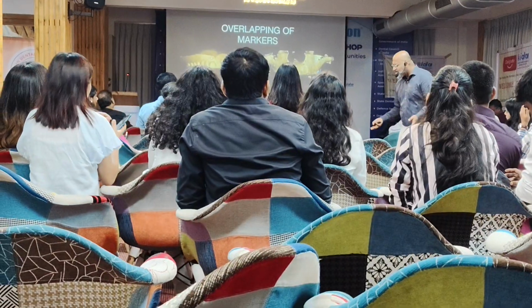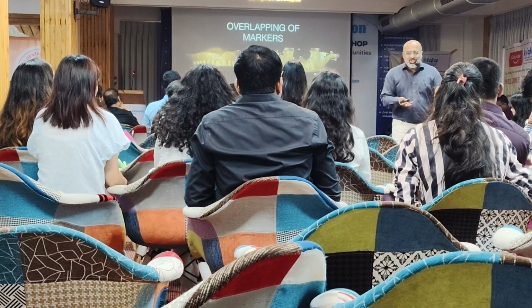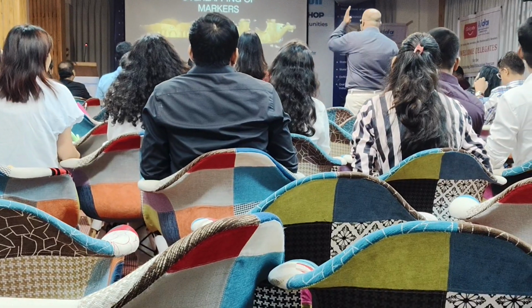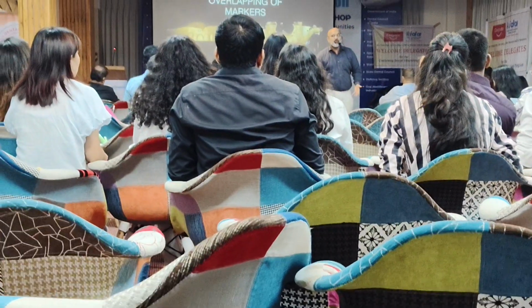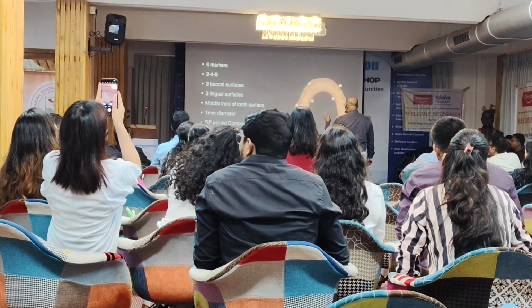Yeah, you can say it loud. To overlap my edentulous image with the denture, so I exactly know where my central incisors are, where my molars are, where my lateral incisors are, everything. So how am I going to place the implants? Do I need a sinus lift? Do I not need a sinus lift?